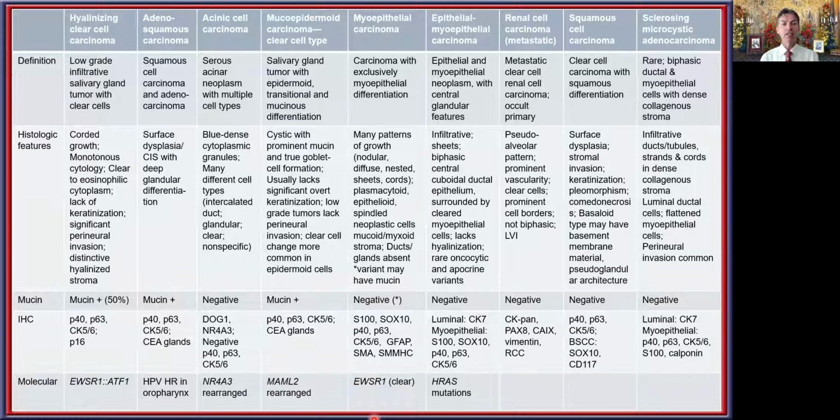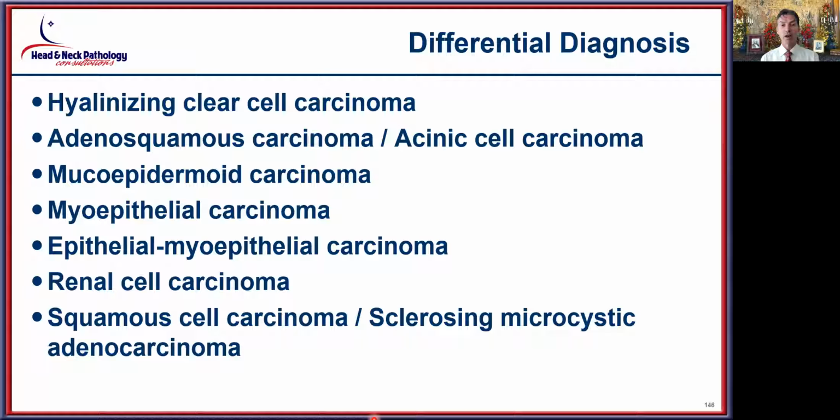So as I now consider this particular tumor category as a whole group of entities, I hope that I have been able to highlight several of the features that can be seen and be used as separation between them, but also to recognize that there will be some tumors where you are not able to make the separation just based on histology and special studies, and will need to actually go to molecular evaluation, and then still recognizing that many times the EWSR1 may in fact be present in a number of these tumors as well.